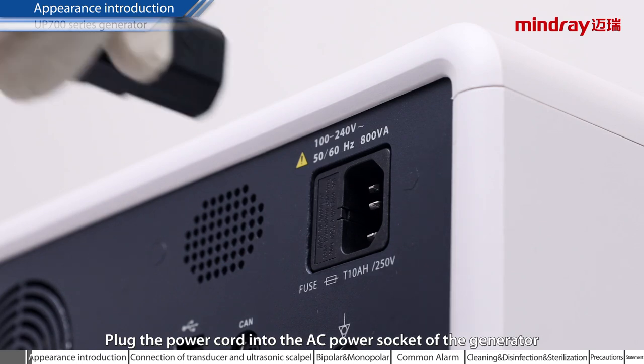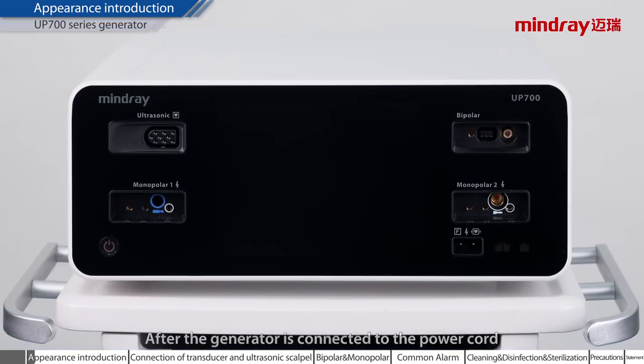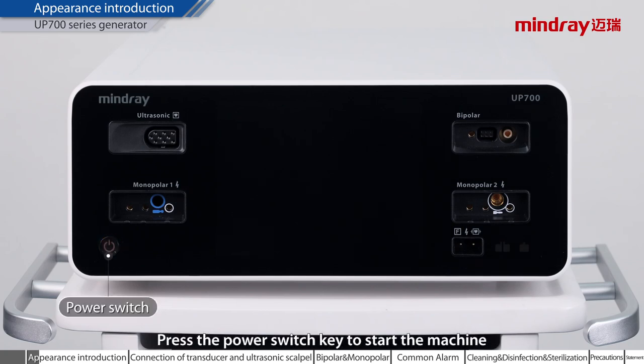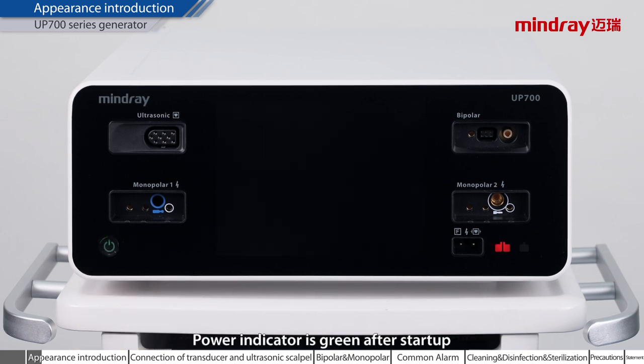Plug the power cord into the AC power socket of the generator. After the generator is connected to the power cord, the power indicator color is orange. Press the power switch key to start the machine. The power indicator is green after startup.